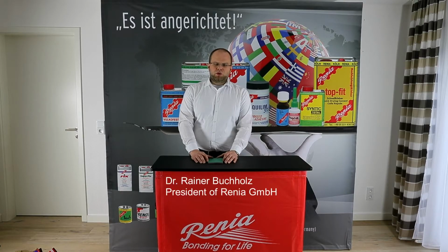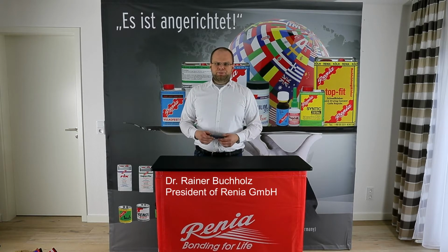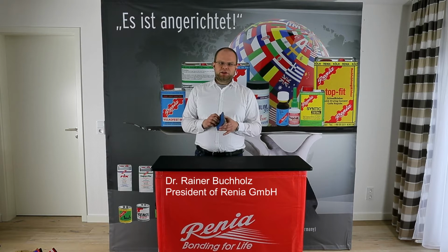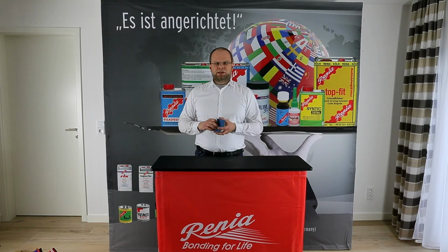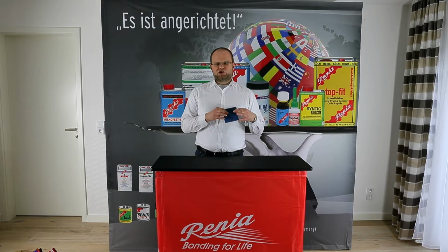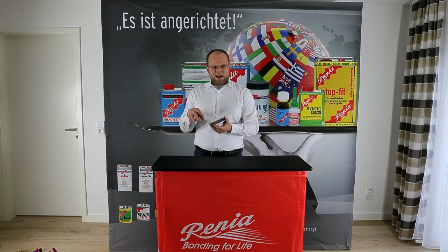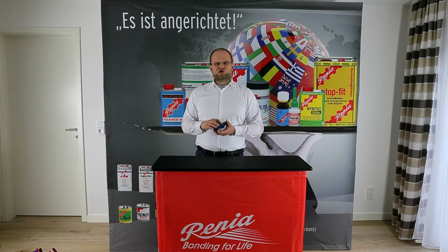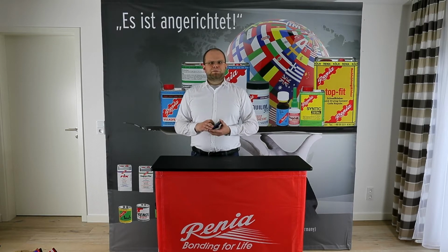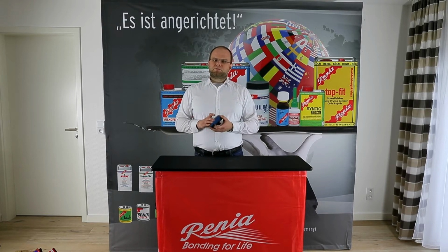Polyurethane, or PU or PUR, is not just used in shoe soles, but also as a build-up material or cushioning material in orthopedic applications, both in prosthetics or braces as a cushioning material and in insoles, either as a cushion or for certain areas that require a very, very soft bedding or even as a top cover. The same rules apply. Polyurethane is a foam, or foamed expanded polyurethane is used here.